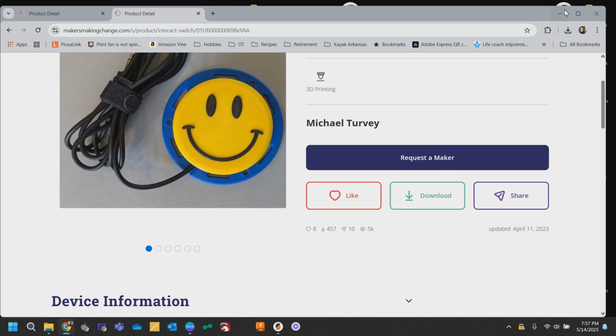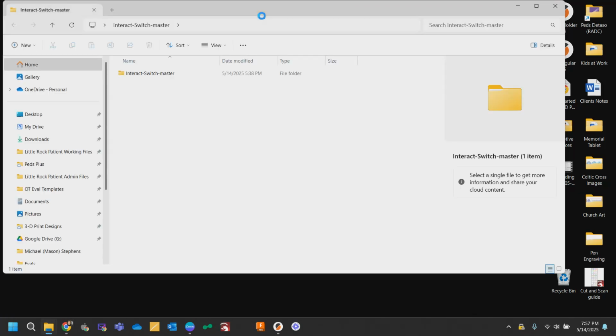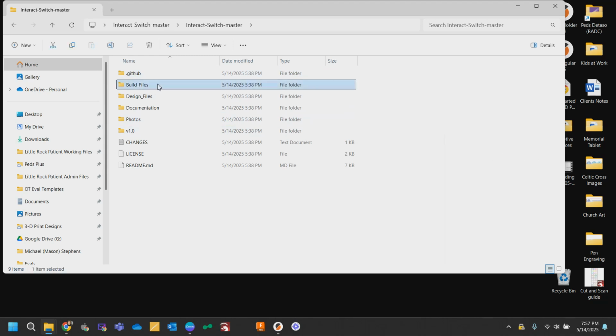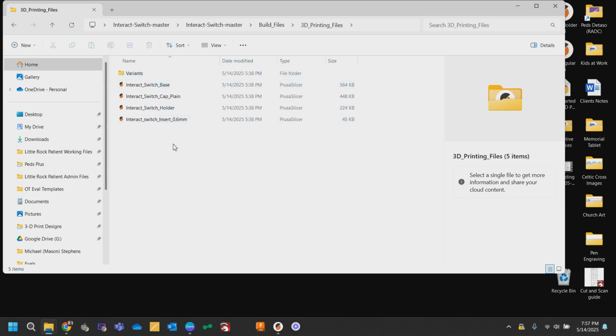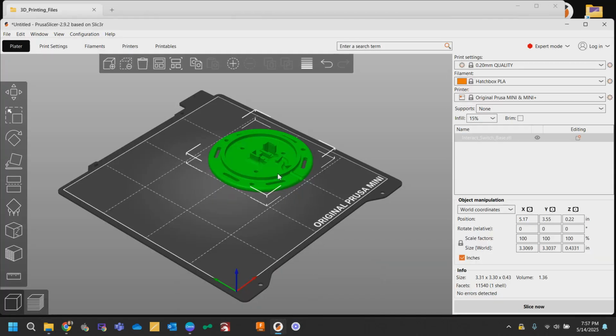Let's download that. Once you've downloaded it, it will come to a folder on your desktop. We're going to go in here and look for the build files. Lots of different files to tell you everything you want to know about this switch and how to make it, but we want the 3D modeling files, and they're in this build files. Here's the 3D modeling files for all the parts of the switch, the holder, the cap that goes on top, and the switch base. We're going to open up that switch base in our slicer program.